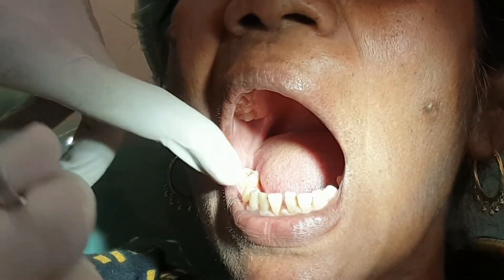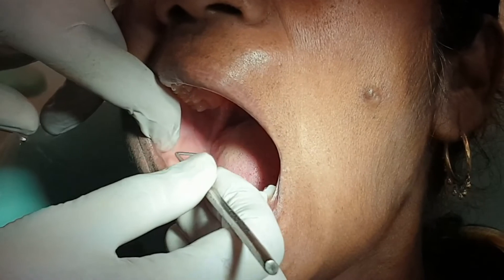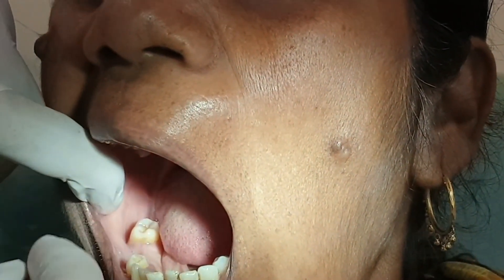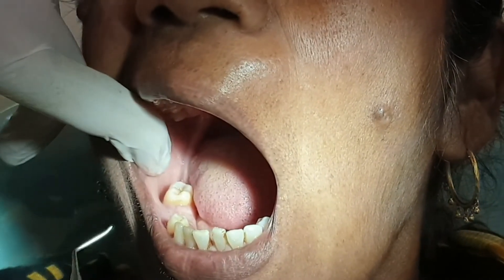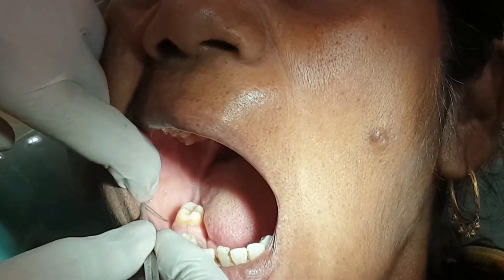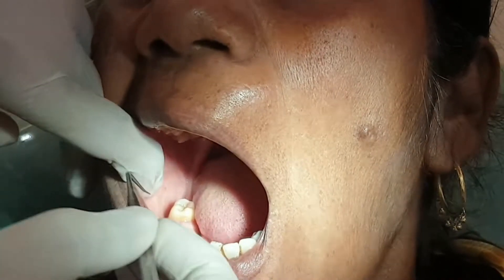The subjective symptoms for the long buccal nerve block include tingling and numbness in the buccal gingiva of the posterior teeth. For objective confirmation, we take a sharp probe and check in the area of interest.